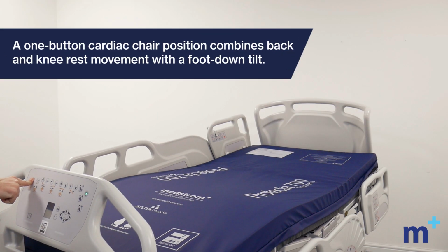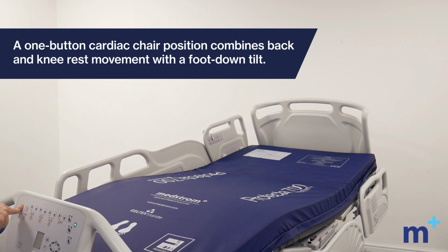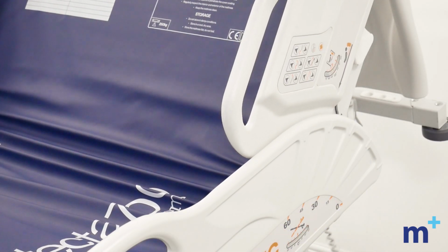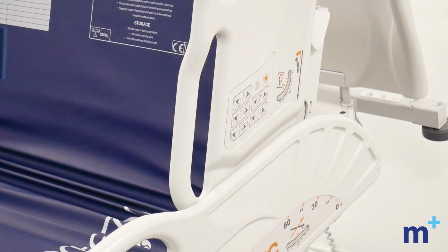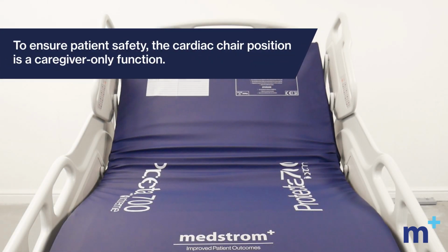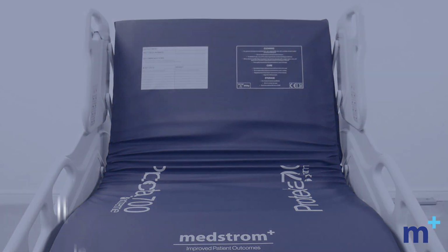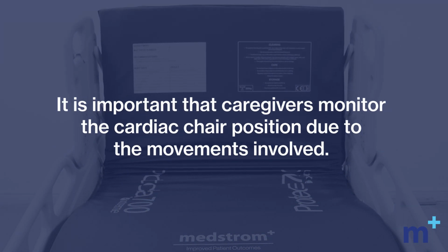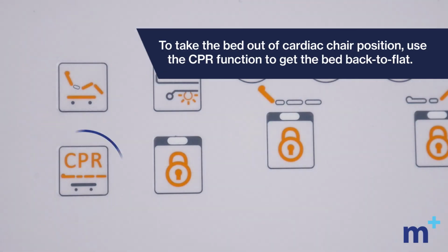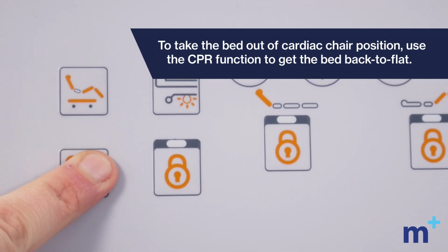A one-button cardiac chair position combines back and knee rest movement with a foot-down tilt, providing a superior position for respiratory systems, as well as eating and drinking. To ensure patient safety, the cardiac chair position is a caregiver-only function. It's important that caregivers monitor the cardiac chair position due to the movements involved. To take the bed out of cardiac chair position, use the CPR function to get the bed back to flat.